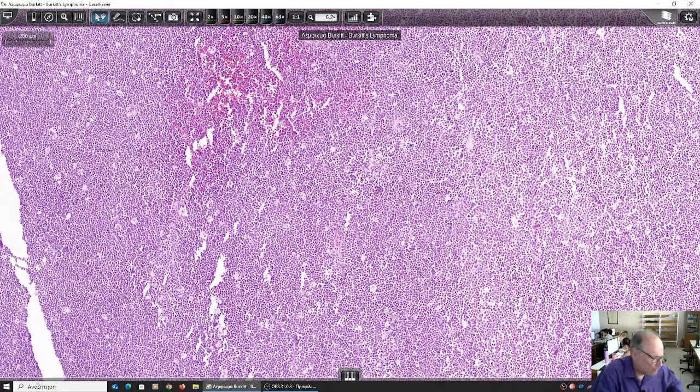And I want to ask you, now we have a high-grade lymphoma, B-cell, non-Hodgkin, like this one. And we had the previous one, B-cell, low-grade lymphoma, the follicular lymphoma, non-Hodgkin. What does the pathologic grade of the lymphoma tell the clinician to do?